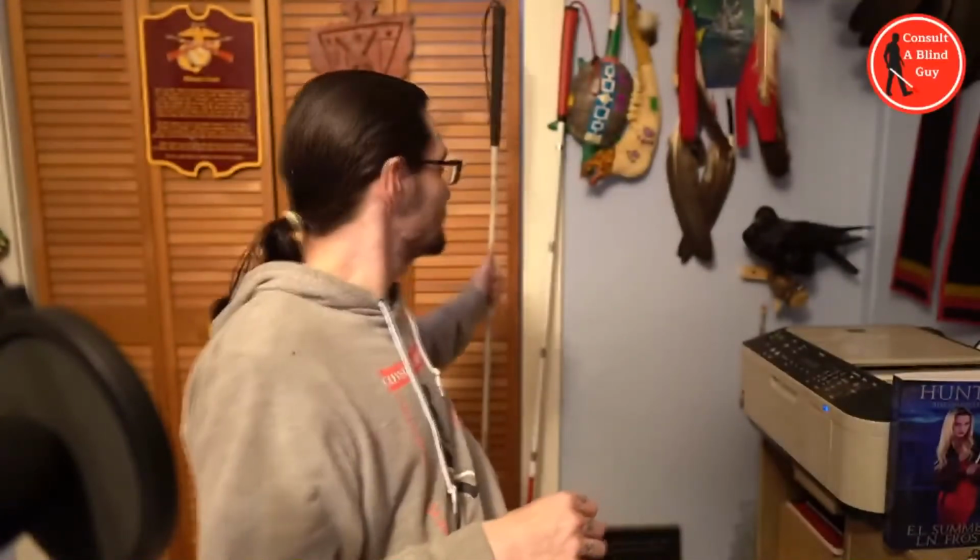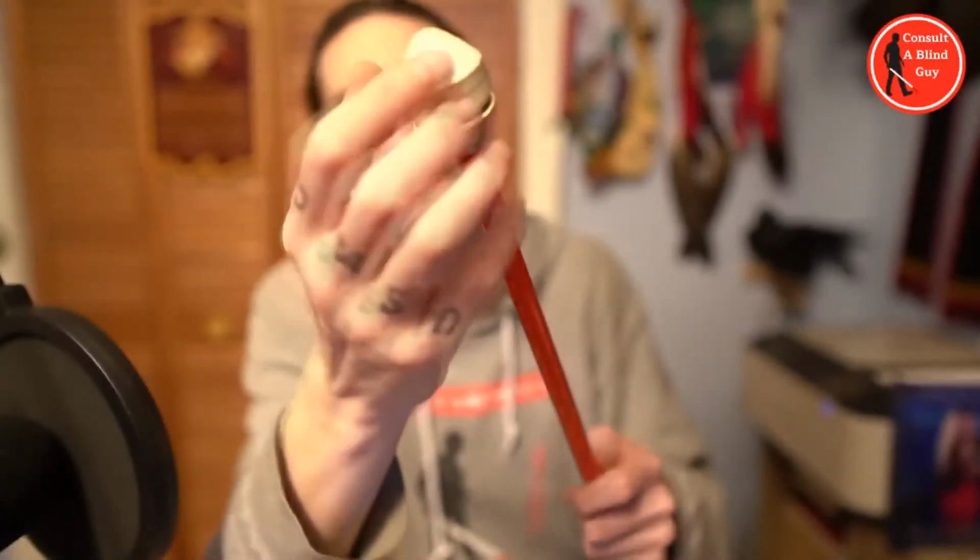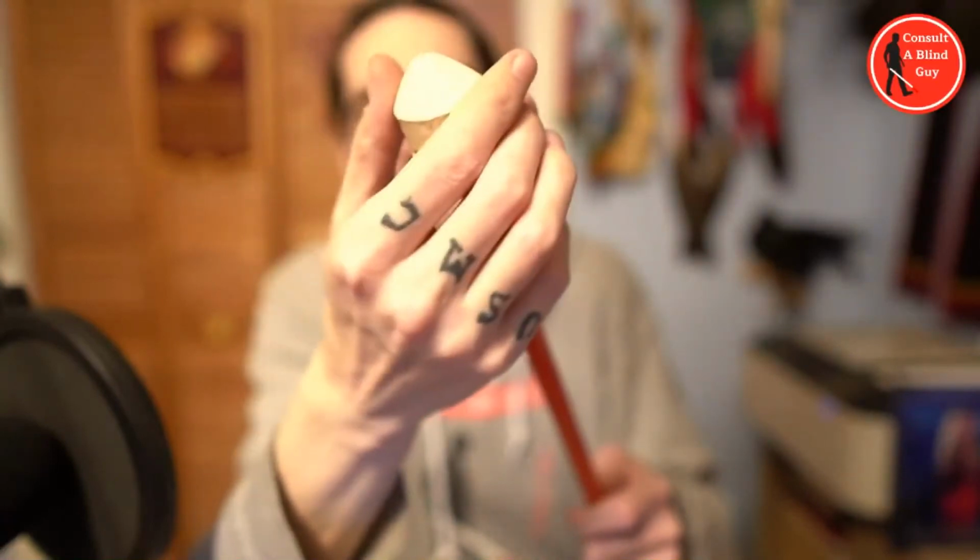And the reason being is this right here. This cane is my standard cane that I received at the age of 16, and I will be 36 in a matter of 6 months. And this cane is still in perfect working condition with the original marshmallow roller tip that I received as a teenager. As you can see, it's got a slight conical appearance to the end now, to where it looks more like a pointed tip rather than the perfect marshmallow tip, because it has been used a lot over the last 20 years.